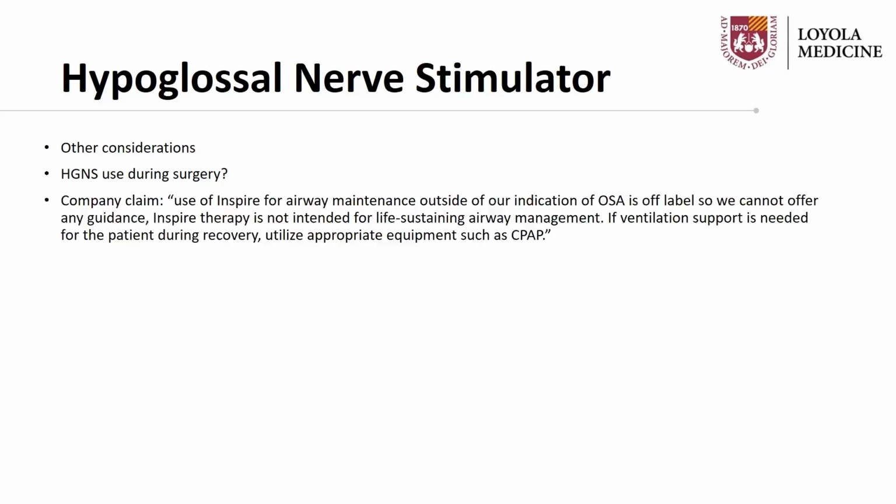So as anesthesiologists, oftentimes one of our main goals during surgery is to identify and treat obstructive breathing. So an interesting point to consider is, is there a possibility to use Inspire to alleviate obstructive breathing during surgery? The company claims that the use of Inspire for airway management is outside of our indication for sleep apnea, is off-label, so they cannot offer any guidance. And Inspire therapy is not intended for life-sustaining airway treatment.